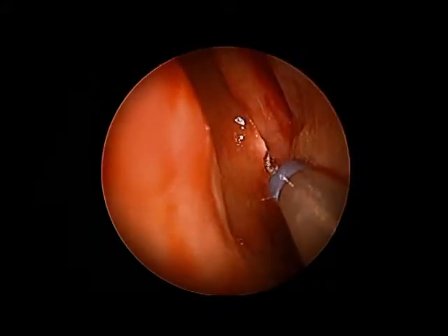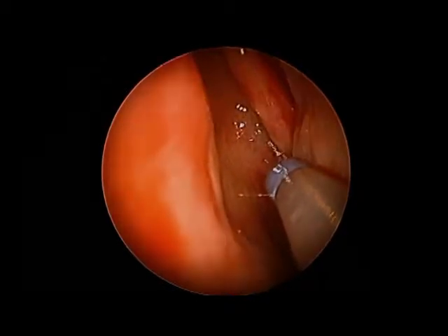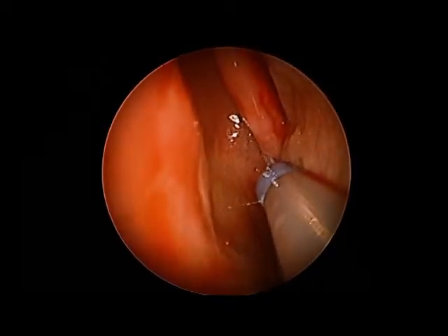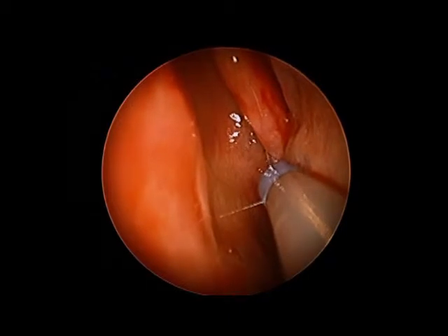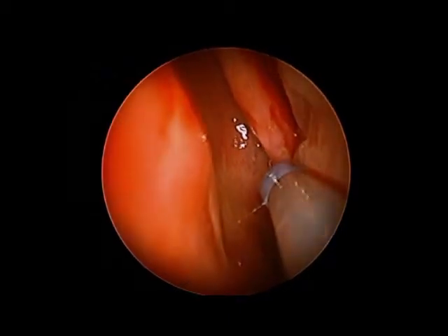The opening is placed at the entrance to the natural sphenoid os, and here you can see a lighted guide wire threaded into the sphenoid sinus.